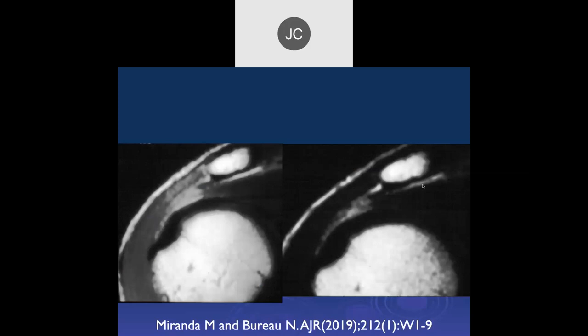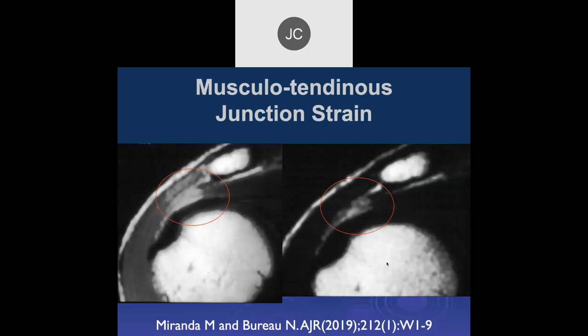There's some bursal-sided partial tearing. This is a PD and a T2 coronal image. This is a young athlete who came in with shoulder pain after athletic activity. This is a musculotendinous junction strain — and again, this is non-surgical.